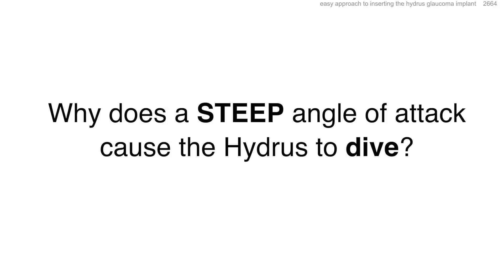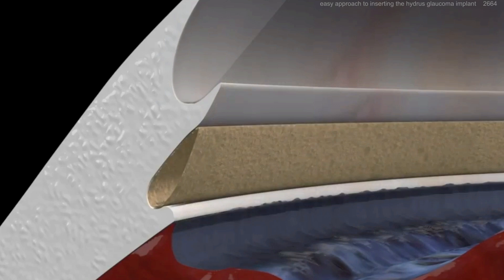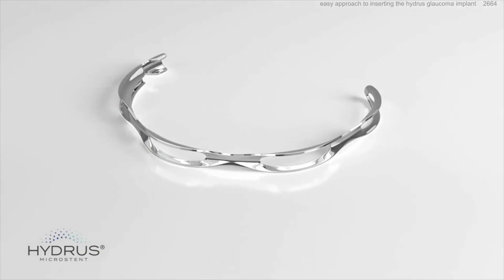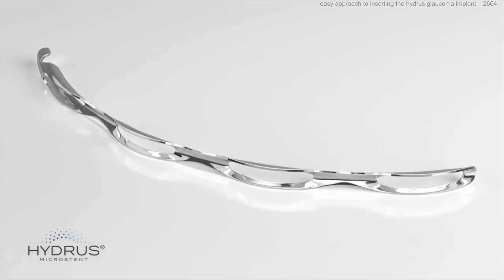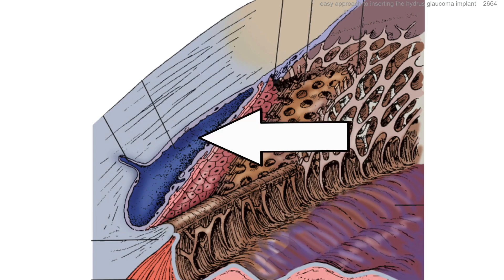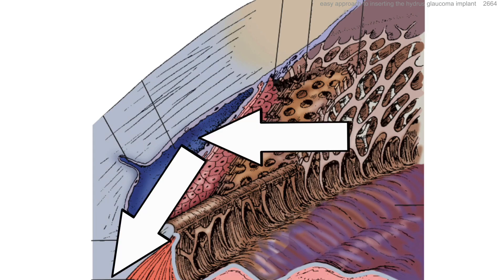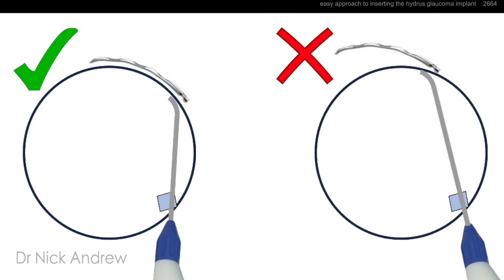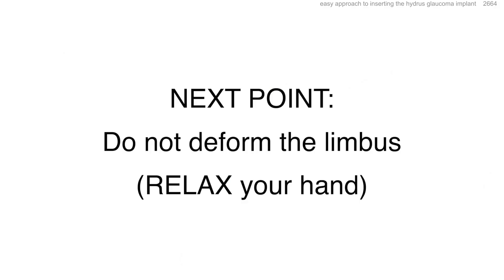Why does a steep angle of attack cause the Hydrus to dive? The reason is due to the angulation of the outer wall of Schlem's canal. The Hydrus is flexible and elastic, but this also means it can twist and deform. If the Hydrus is driven forcefully into the outer wall of Schlem's canal, it will twist and be deflected posteriorly, causing it to dive towards the iris root. A steep angle of attack drives the Hydrus forcefully into the outer wall and causes it to dive posteriorly towards the iris.